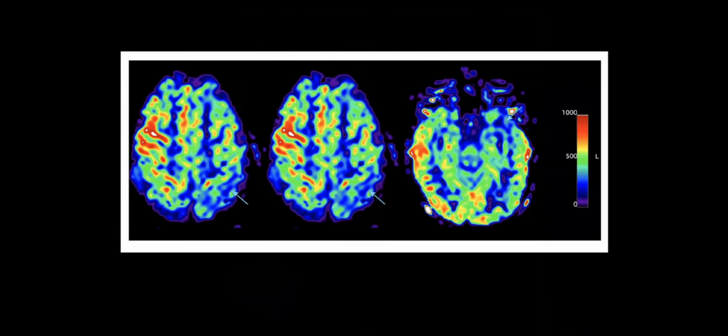ASL also shows abnormally low temporal as well as parietal low blood flow, even evident on the non-processed, non-statistically analyzed color maps, which we can see quite easily here just through visual inspection.